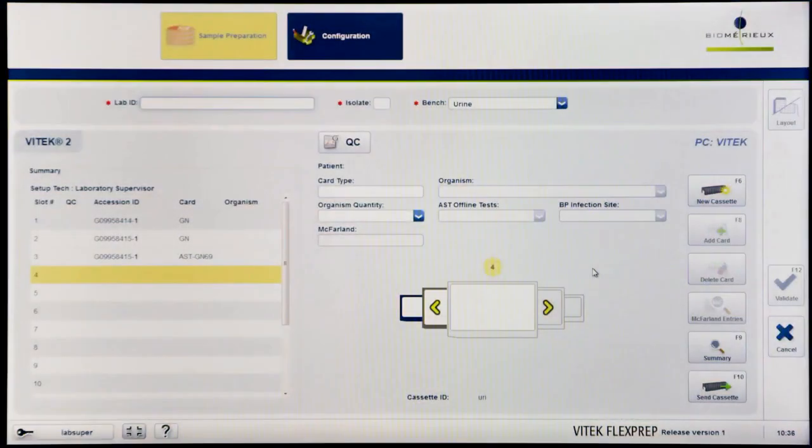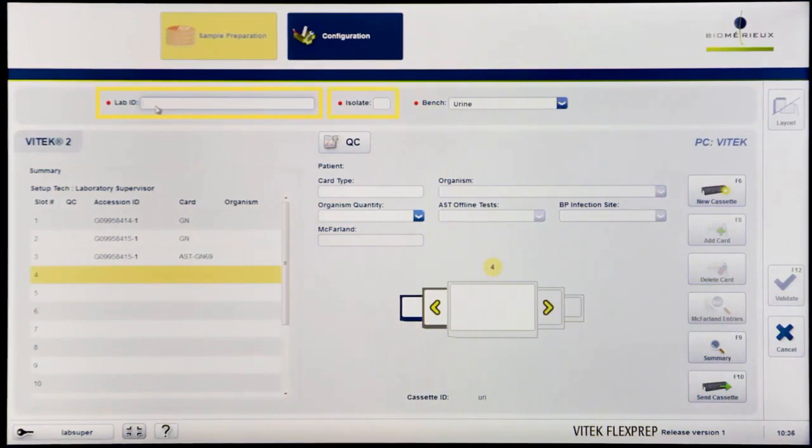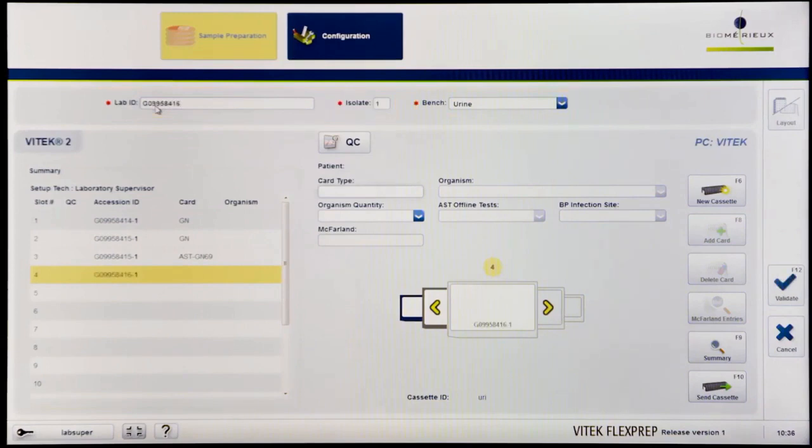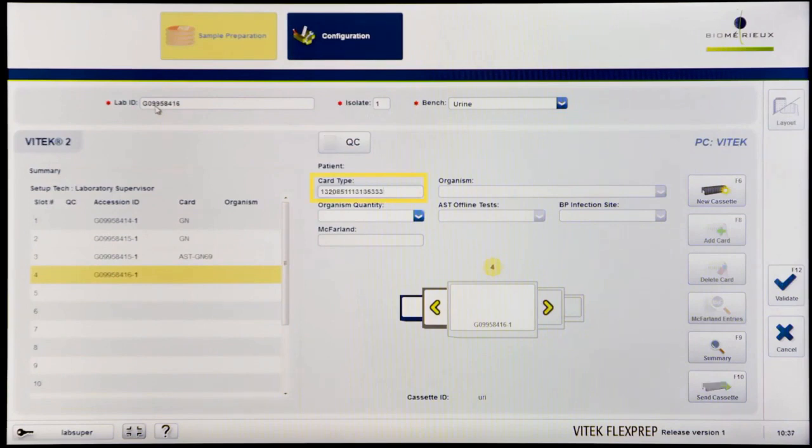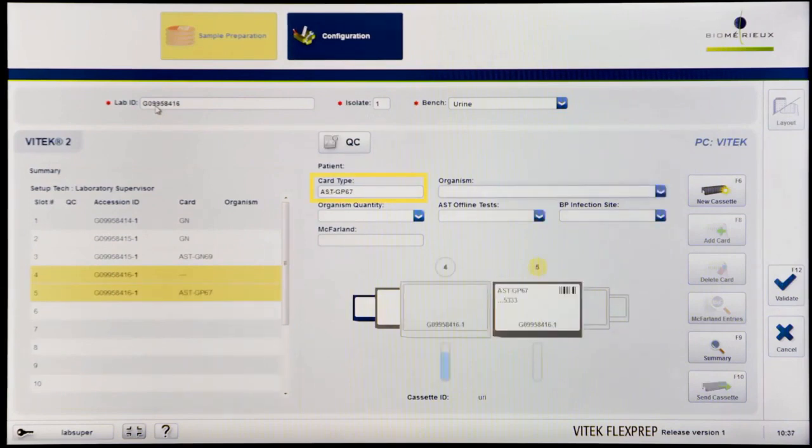When entering a single AST card, enter the lab ID, isolate number, and bench if enabled. On the Cassette Definition screen, enter the AST card barcode number, either by scanning the barcode number or by entering it manually.